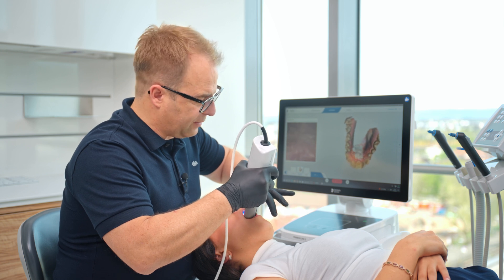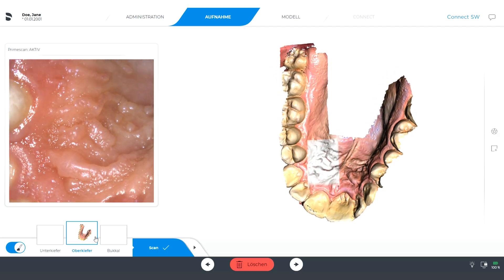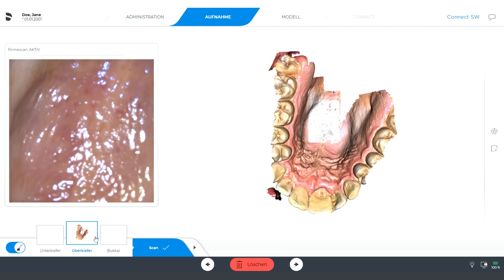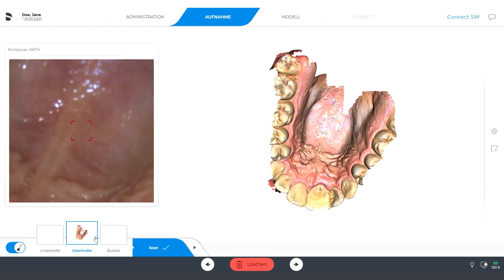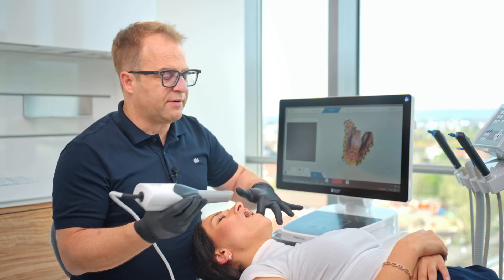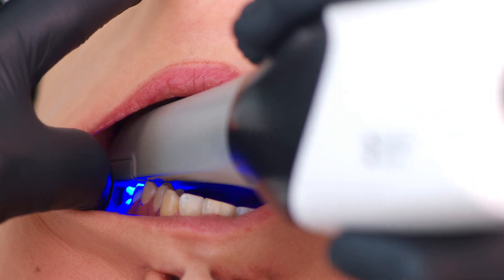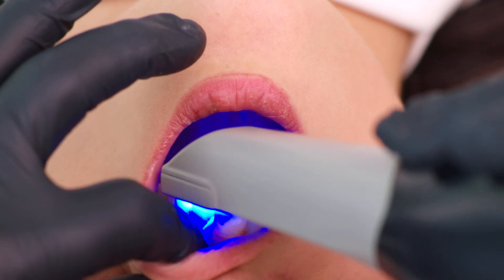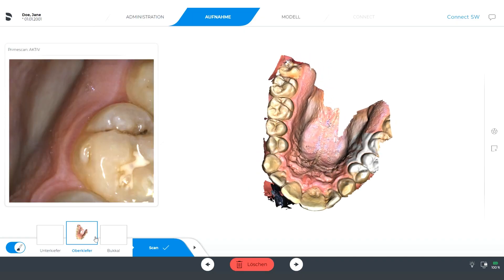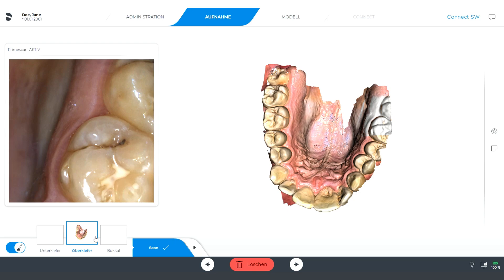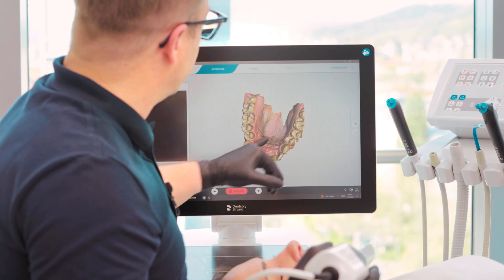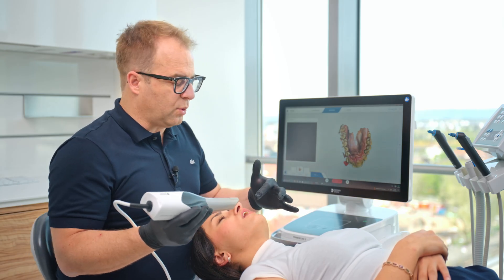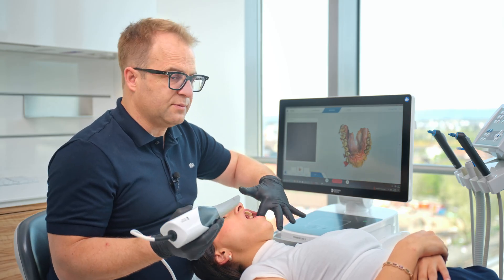I will also scan the palate itself. This is very important because later, if I need to match and superimpose different scans, the palate is very, very important to get an accurate superposition. Now when I have completed the palatal area and surface of the teeth, I can scan the occlusal part. We now have the occlusion. On the buccal area in the posterior molar region, this is a bit more difficult.